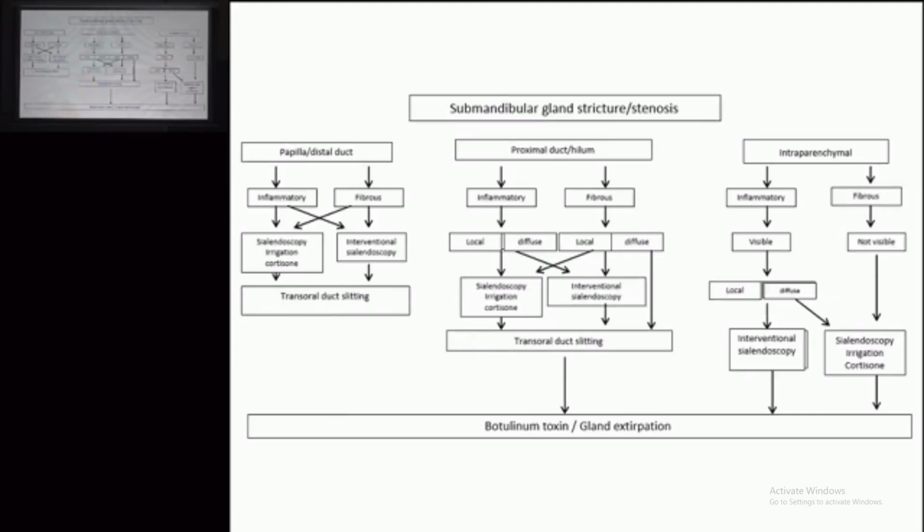So you need very specialized training before you can start doing these cases. It involves a lot of costly equipment and accessories. So this slide shows you pretty much that you cannot do with one scope or with one instrument. You need a plethora of instruments, because if you are committed to doing a diagnostic, then you should be committed towards doing a therapeutic removal also.